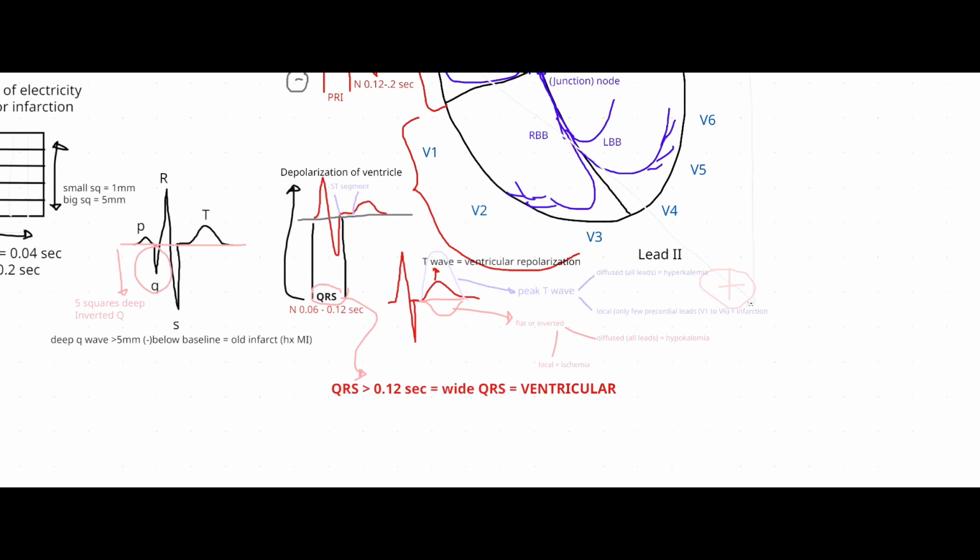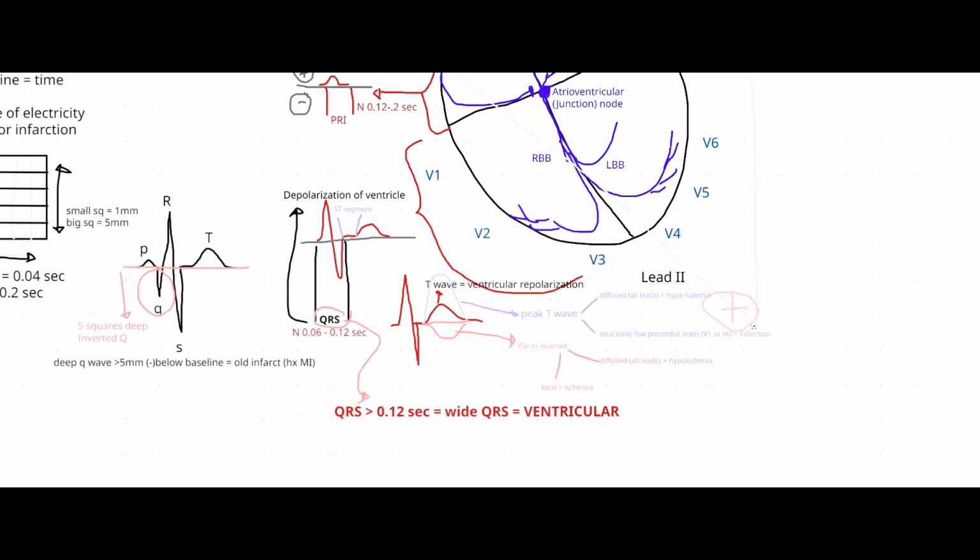Say again? We'll start with PVC, which could be hypomag, hypocal, hypoxia, hormone deficiency. What did you guys say? Bundle branch is different. Okay. But in an RBB, yes, there's also a ventricular QRS widening, but you'll see rabbit ears, right? So bundle branch block, that's a little bit advanced, but we'll go ahead since you mentioned it.